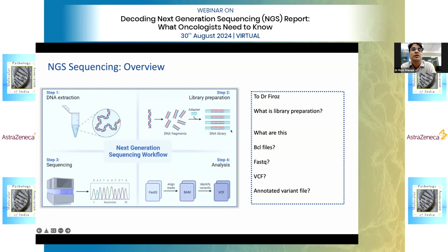Again, FFPE tissue has a lot of quality issues. So you need to check whether the DNA is suboptimal or optimal for amplification. If not, then you have to re-extract the DNA, so that also adds to the time. The same thing goes for the RNA. You extract the RNA, do the quality check, and look at the quality. If the quality and quantity are good enough, then you go to the next step.